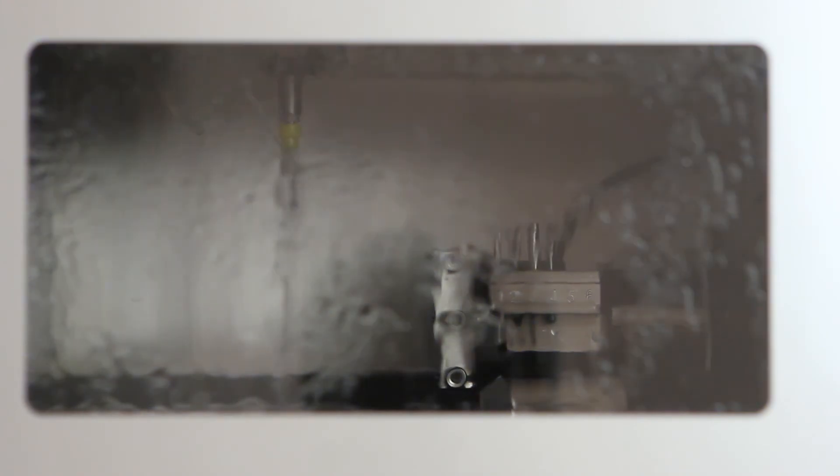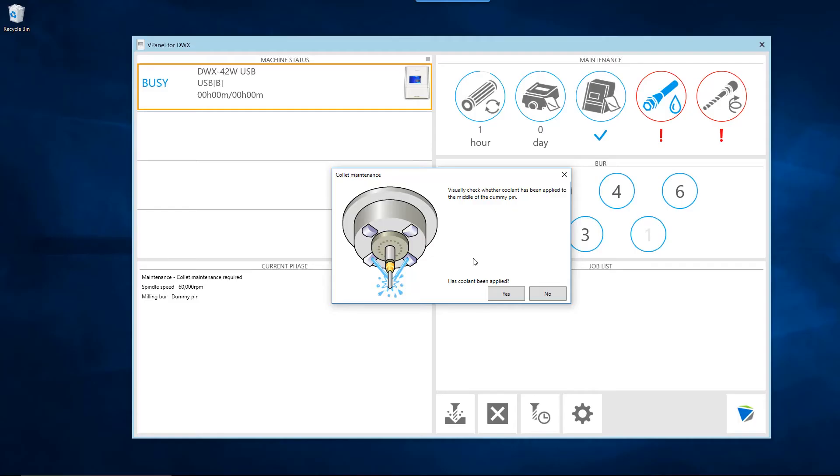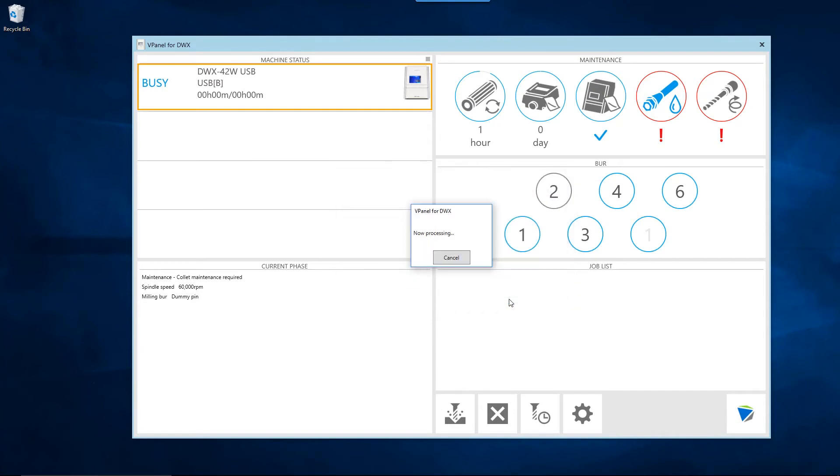Once the coolant flows through the nozzles, confirm if the coolant is spraying directly onto the dummy pin. If yes, click the yes button in the panel to complete the collet maintenance procedure. Otherwise, click on the no button to complete the collet maintenance operation.